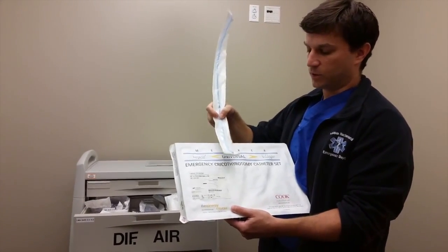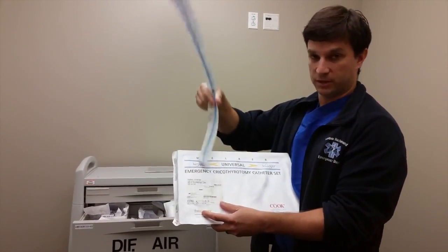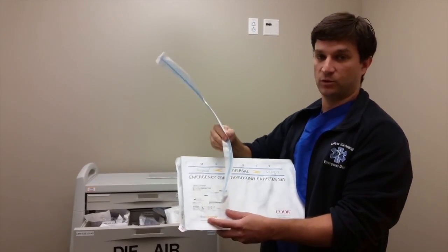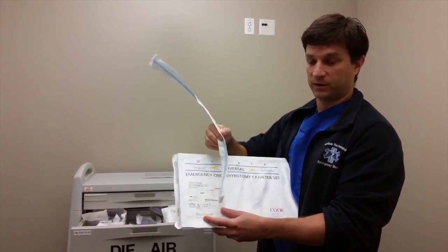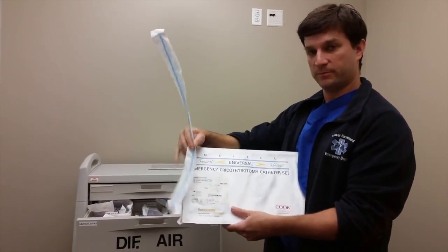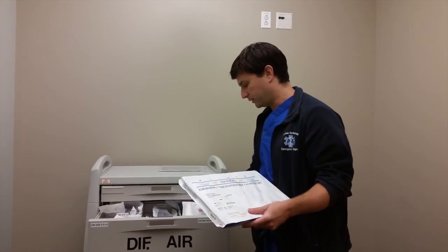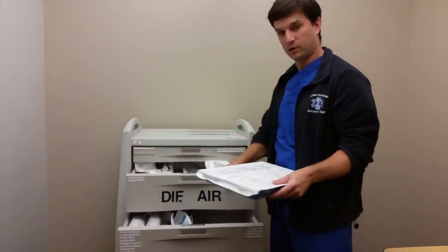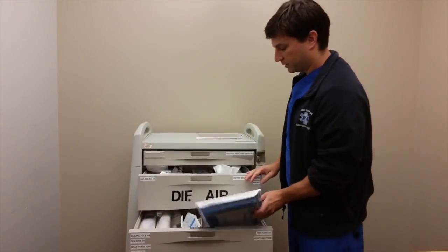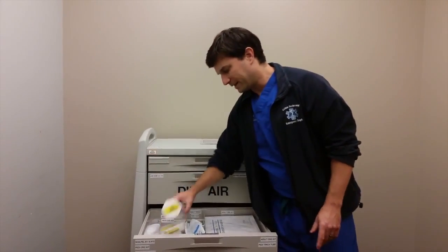And that does happen. So one way around that is that once you make your cut and you pull up with your tracheal hook, you can pass the bougie in, and then your bougie secures your passageway. You can feel the tracheal rings, you can feel more secure that you're in the right space, and then just pass your cric tube right over the bougie. So we'll also use these two things together. But for now they remain in separate drawers just because algorithmically the way the bougie usually comes into play is without the cric kit.